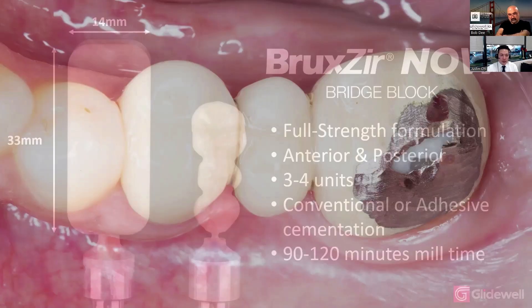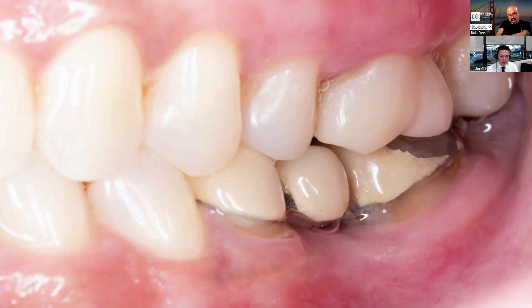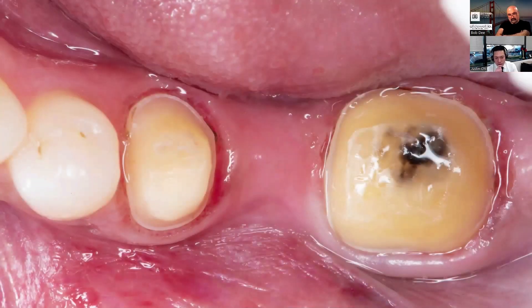Here's this case: you can see this PFM bridge the patient had from 18 to 20. This PFM bridge has seen better days. Looking from the buccal, you can see a little bit of recession around the margins. We take this off and get the preparations cleaned up. This was one of the most challenging cases I've ever had to prep — the patient was a gagger and could not open much at all.